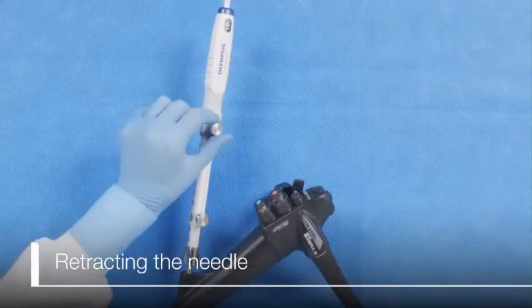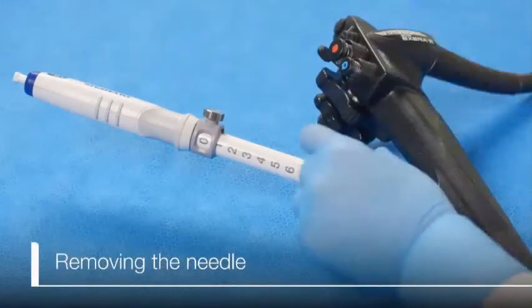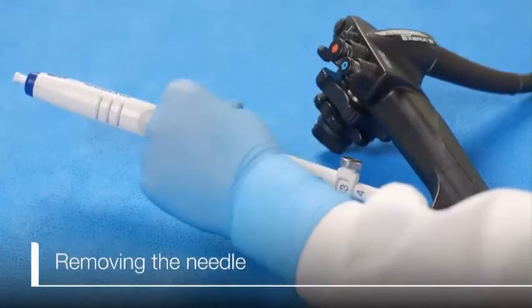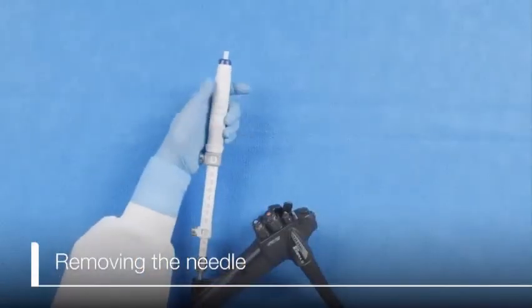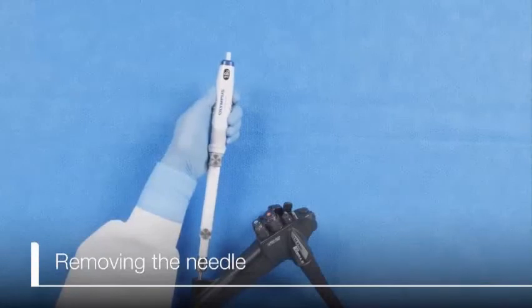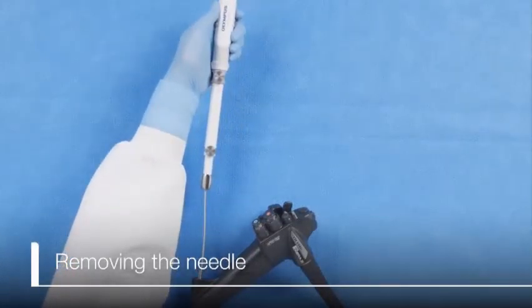Then the needle can be locked in position by twisting the locking knob. To detach the needle from the scope, ensure that both the needle and sheath locking knobs are secured. Then twist the needle to unscrew the locking connection from the biopsy port. Then carefully withdraw the needle.